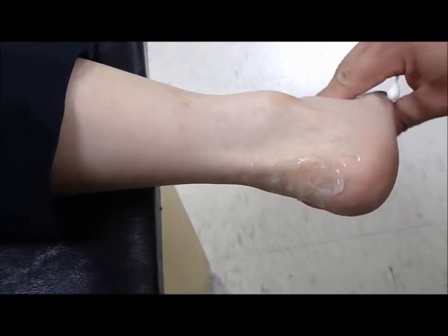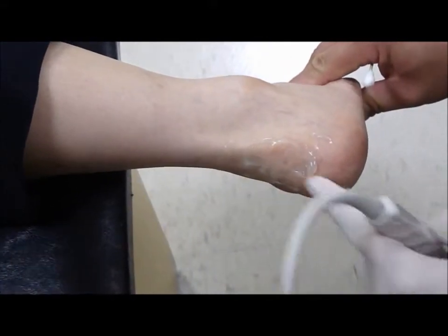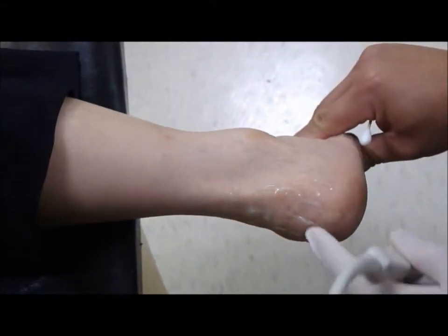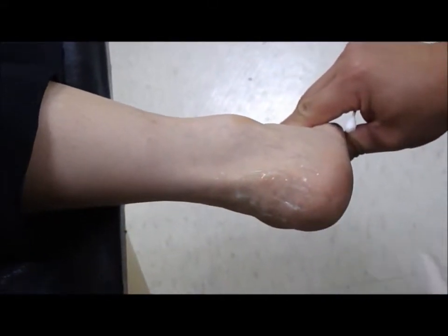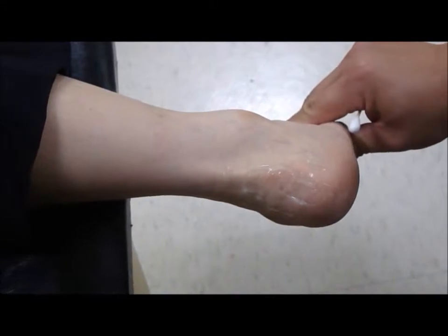During ultrasound examination of the posterior surface of the heel, the patient assumes the prone position.